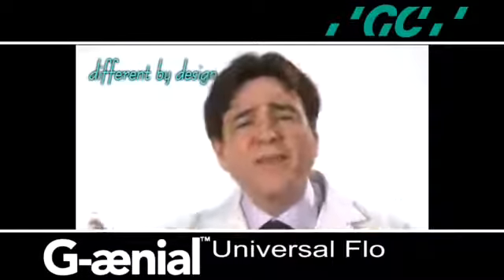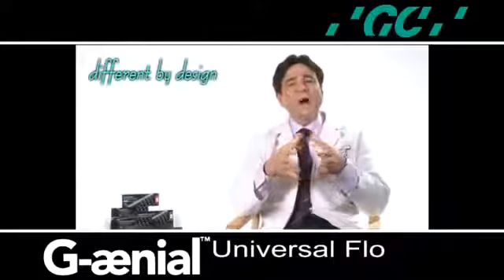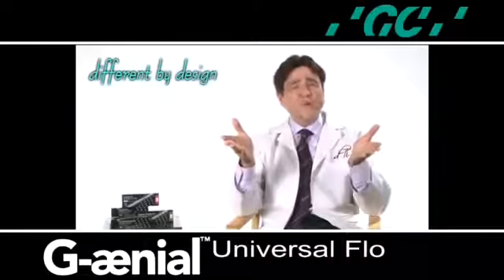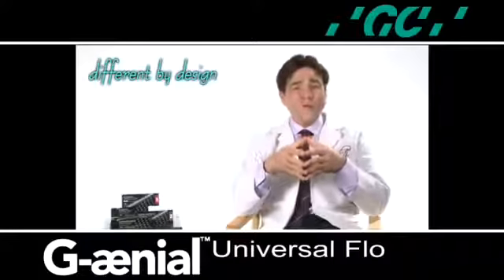And what other material has so many uses as these next generation flowables? The following presentation will describe a few of those many contemporary applications utilizing Genial Universal Flow.